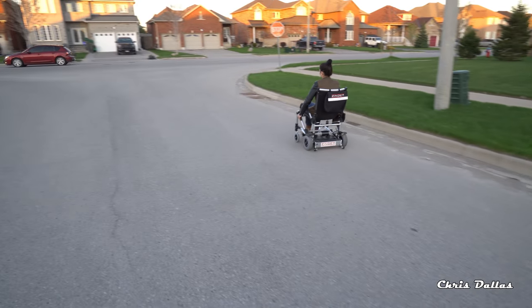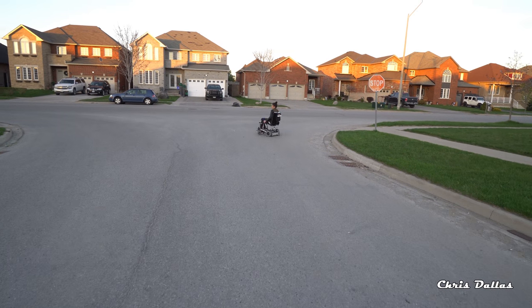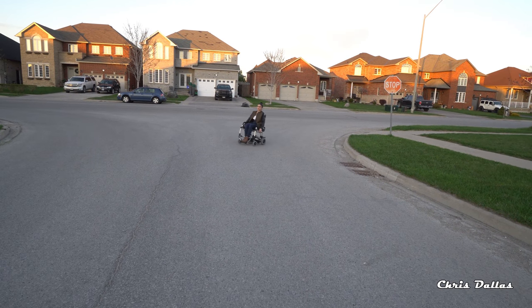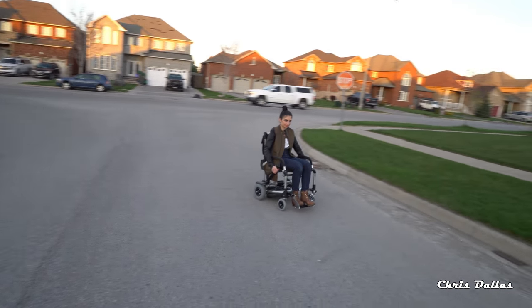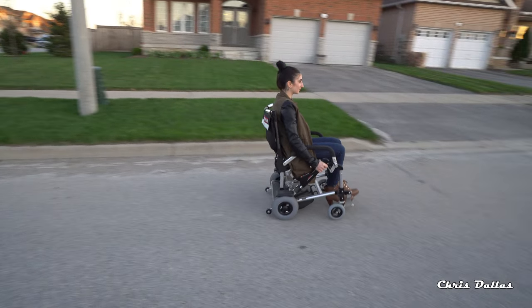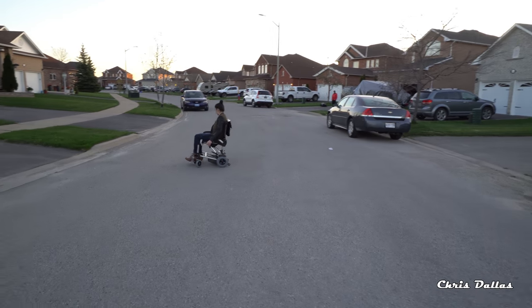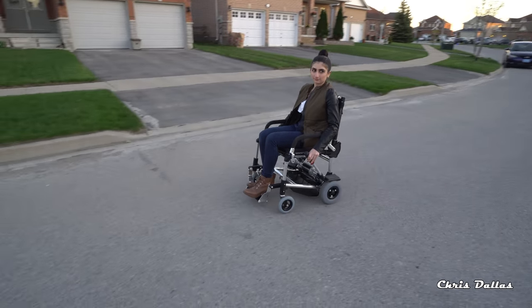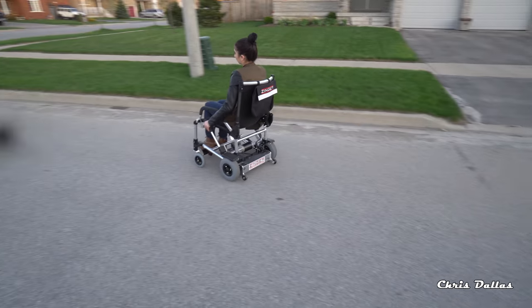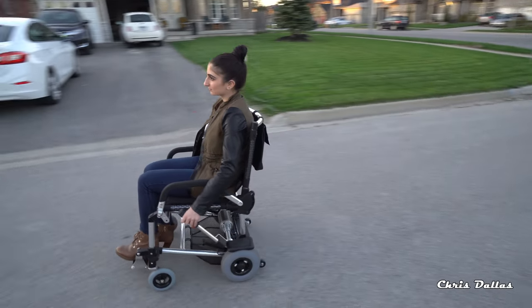She can do this speed for about 8 miles. She's got a range of about 11 to 12 kilometers, which is very good — with a chair, mind you. And if you want an extra battery, you can get one. You can actually get a battery that will give you 10 miles or 16 kilometers. They sell separate batteries — I believe that battery is about $350.